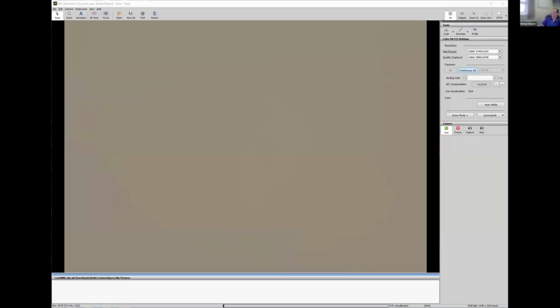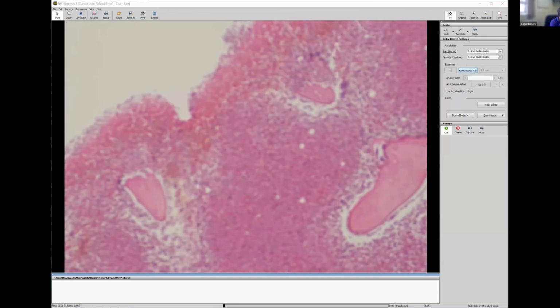Okay. So this is actually a 16-year-old male. Unusual for it to come through the adult service, actually, and presents with a high white cell count. We have a separate pediatric service, so I'm surprised this didn't go there.